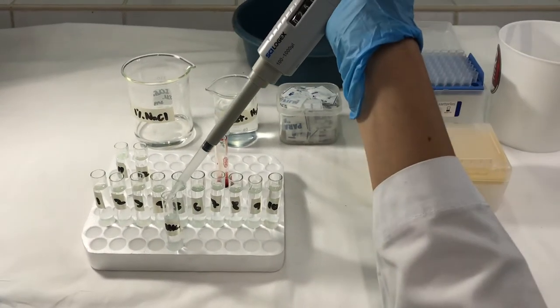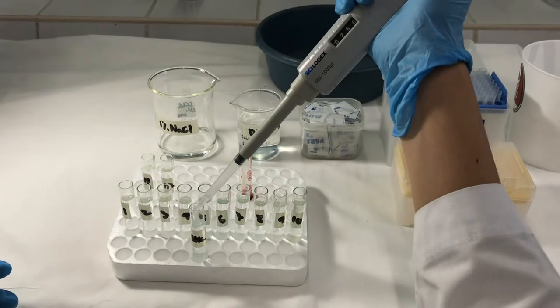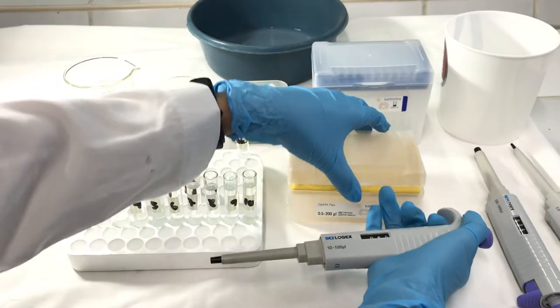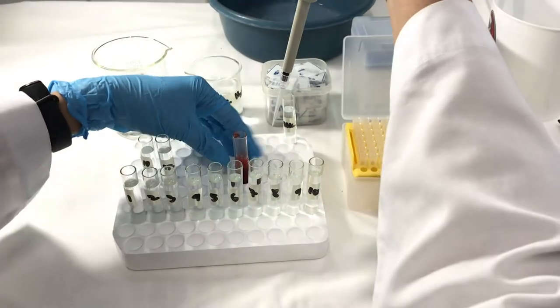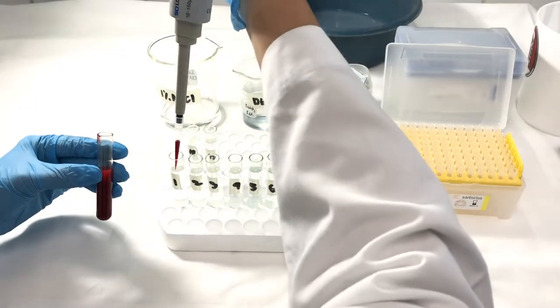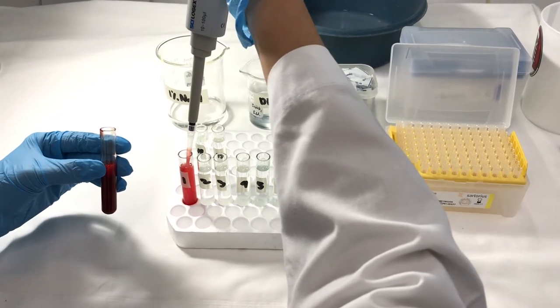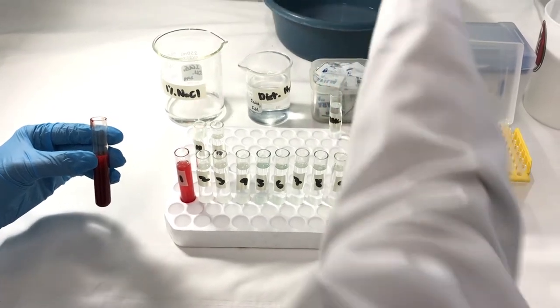After you have placed the appropriate amounts of sodium chloride stock solution and distilled water into all your various tubes, we are now ready to dispense our blood. Place 50 microliters of defibrinated blood in each of the test tubes, as well as a test tube with only distilled water. Make sure to mix the blood in each test tube and change tips after every tube.